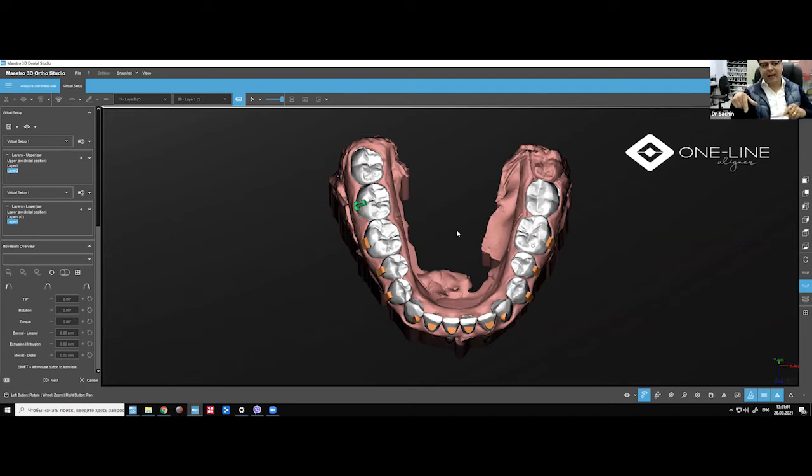So we use pressure form, BioStar, and we have one BioStar and one MiniStar in the lab. We also have as a backup the Chinese vacuum one, in case one day something happens and the compressor is not working. The vacuum one doesn't need a compressor, but the BioStar and the MiniStar we use with the compressor. So that is just a backup which is there in case something happens and we need to work with something else.